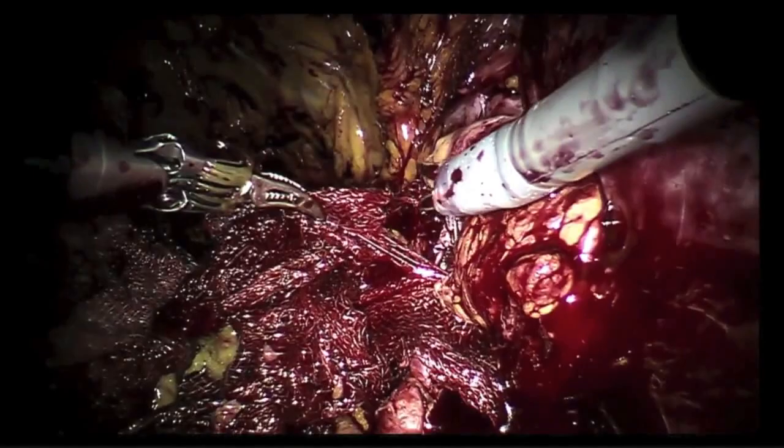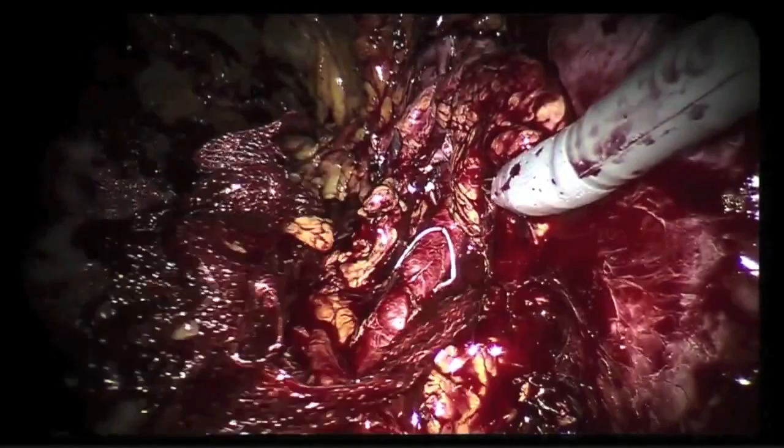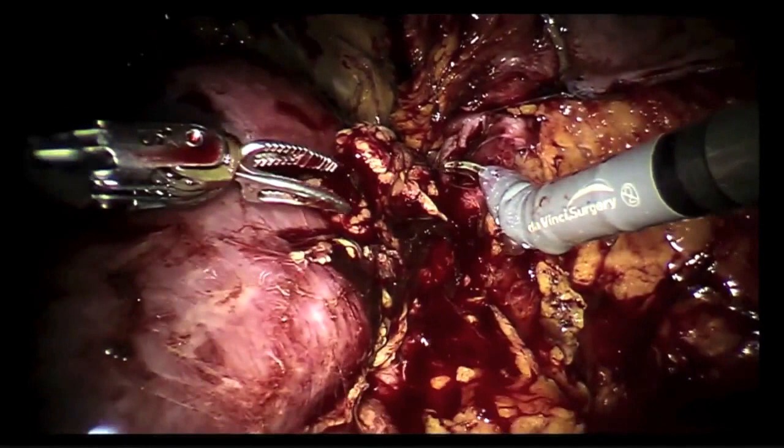See, these are these beautiful little clips that he had put in, Dr. Palat. Here we go. So it's nice and pink now. The only thing it has to do is to make urine now. Okay, I'm not going to mess around over there.